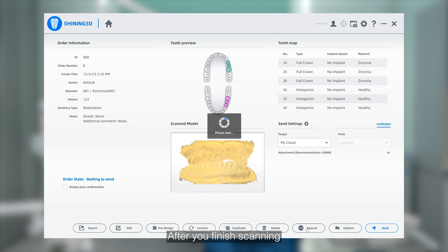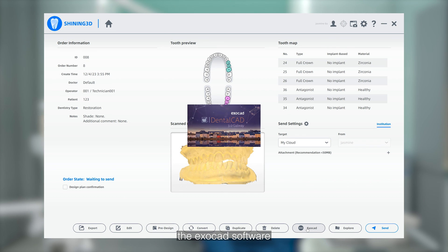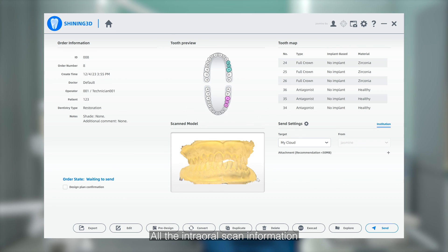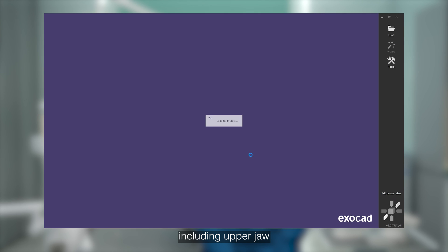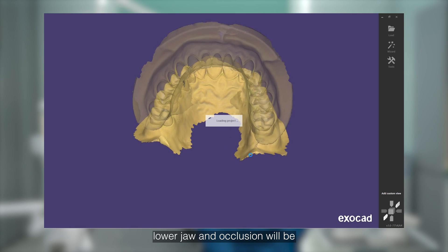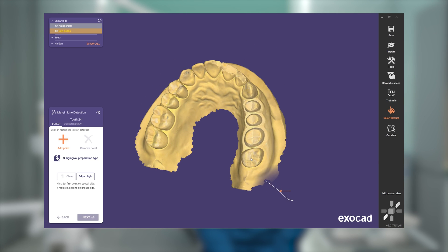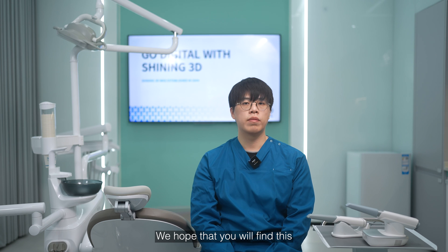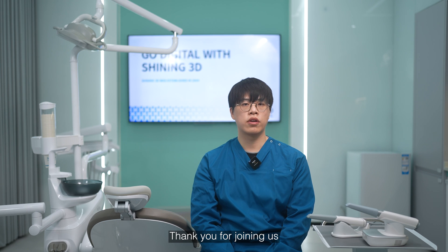After you finish scanning, just click on the ExoCAD button to directly open the ExoCAD software. All the intra-oral scan information, including upper jaw, lower jaw, and occlusion, will be automatically sent to ExoCAD. We hope that you will find this instructional video helpful. Thank you for joining us.